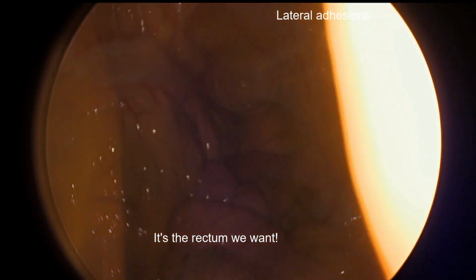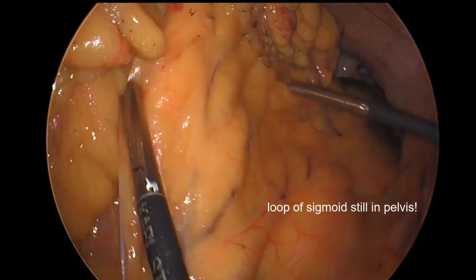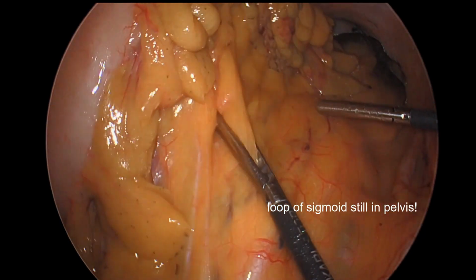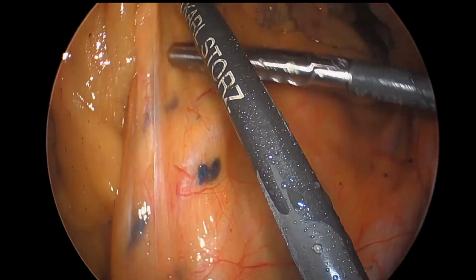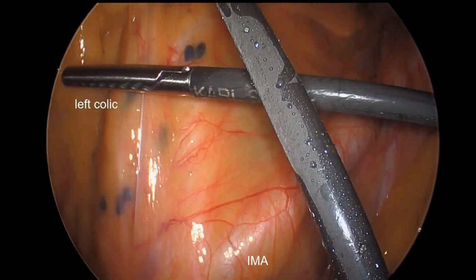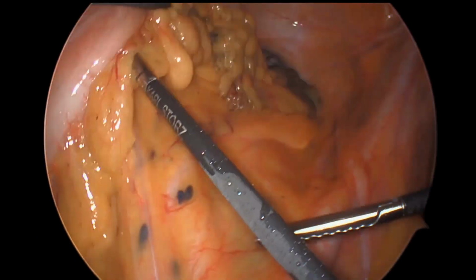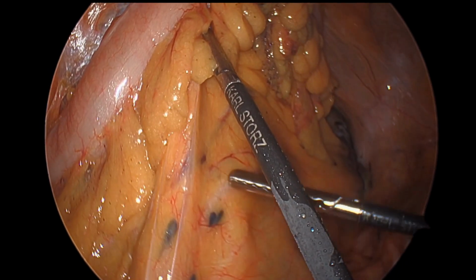So here's another case where things don't go exactly the way we want it. So remember, it's the rectum that we want, and this patient has some adhesions which are tethering the sigmoid colon into the pelvis and are not allowing us to completely dissect it free. Another clue here is that you can see some tattoo on the IMA pedicle, but it's not immediately clear to us that that's actually the IMA pedicle.